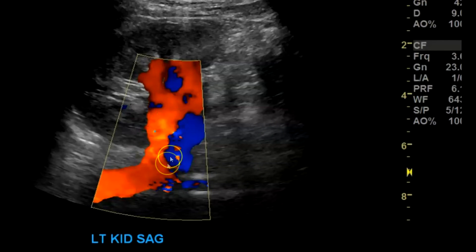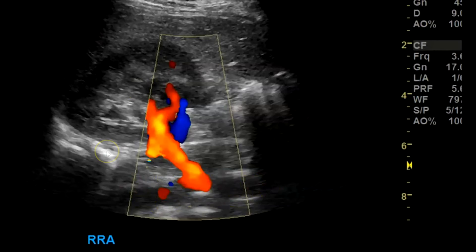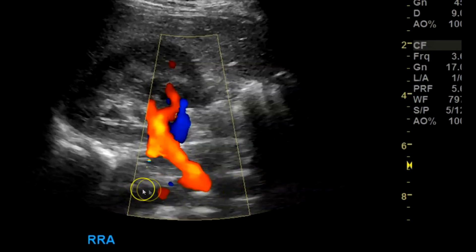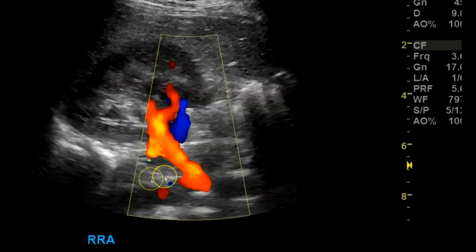You should see the vessels coming off the aorta going into the kidney. Sometimes it's a little difficult to see the vessel in gray scale, so once you put color Doppler on you should be able to pick them up. Here's the artery and vein — you can lower the gain or increase the scale to reduce blooming artifact of the color flow. Here's an example of the right renal artery coming off the aorta coronally. Here's the kidney in coronal — the aorta would be here. Sometimes the aorta won't fill in color because it's at nearly a 90-degree angle to the beam, so you can angle the transducer inferiorly or superiorly, increase the gain, or use power Doppler.